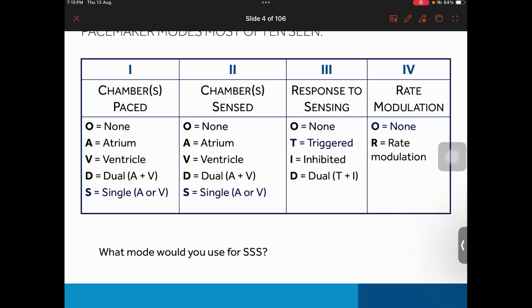So I put R, as the pacemaker has a sensor. We'll discuss also how to translate the effort into an increase in heart rate. There are four types of sensors that can mimic the actual response of the sinus node. In another case, we also put in R.